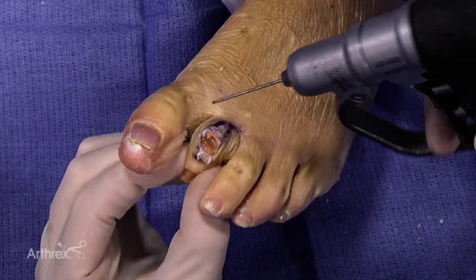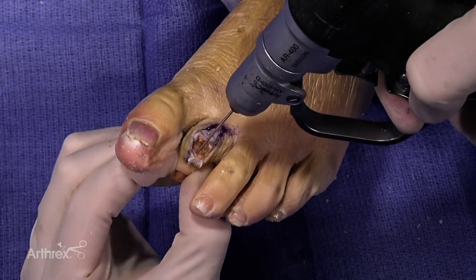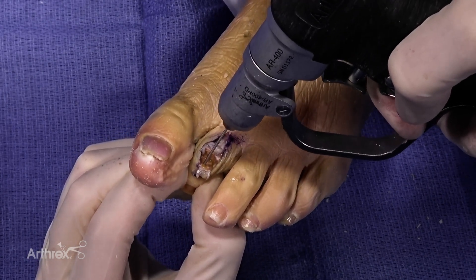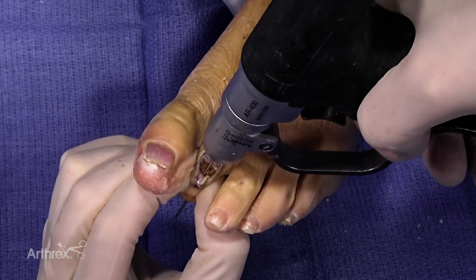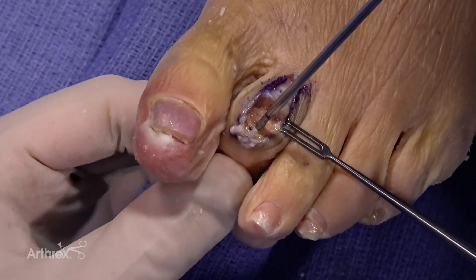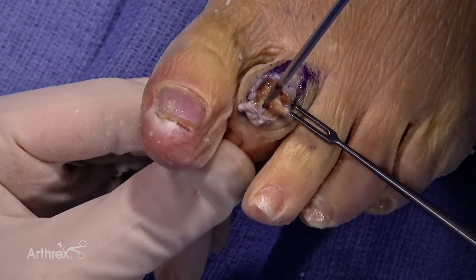Remove the K-wire if it doesn't come out on its own, and now we move to the middle phalanx. Using the same guide wire, center this in the middle phalanx, and we are going to extend this out the end of the toe. This is a 2.5 millimeter drill. Again, soft bone — I usually go nice and slow and bottom it out to the laser line.